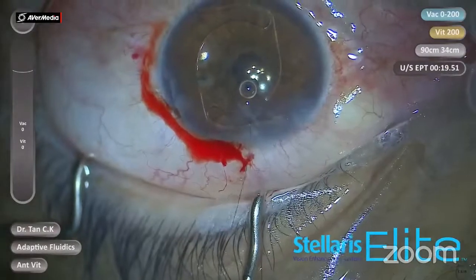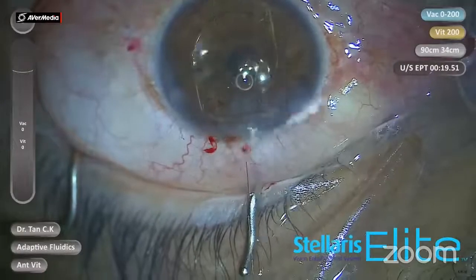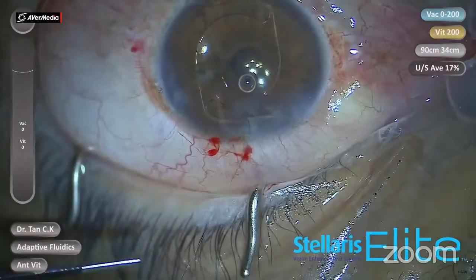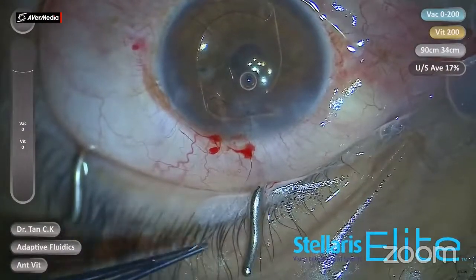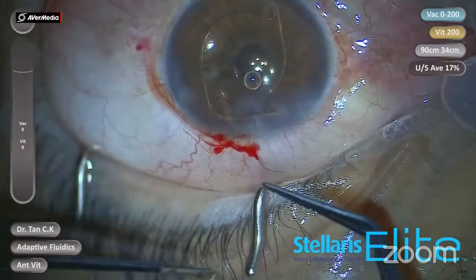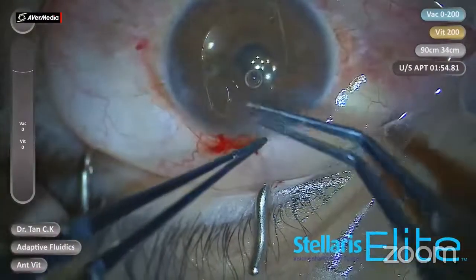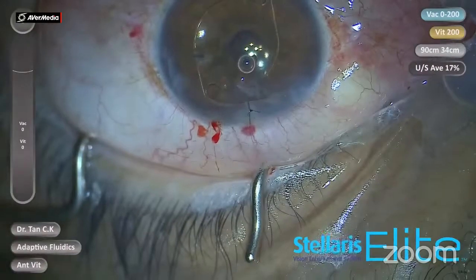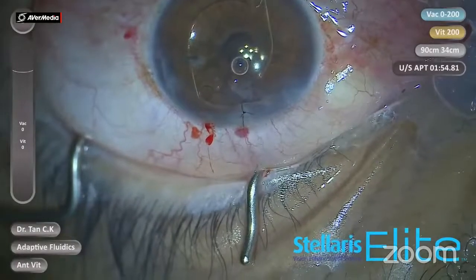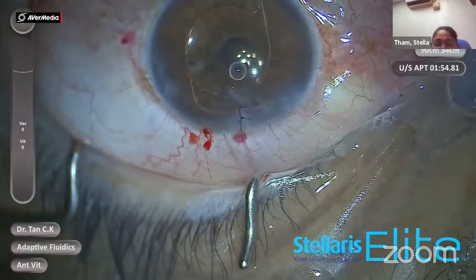It's when the anterior capsule is eccentric, or the CCC is eccentric or not intact. If you cannot see the anterior capsule very well, and the CCC is very large, that's why you cannot put the lens in the sulcus. We worry about that, but most of the time you don't touch your anterior capsule so much. It should be okay. Usually you can put it in the sulcus.